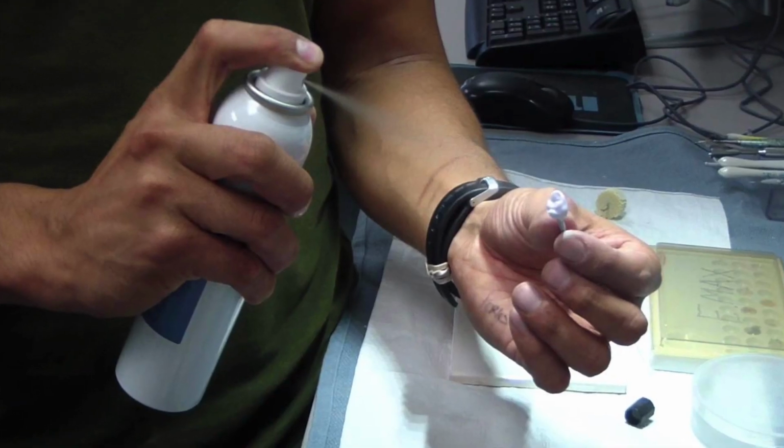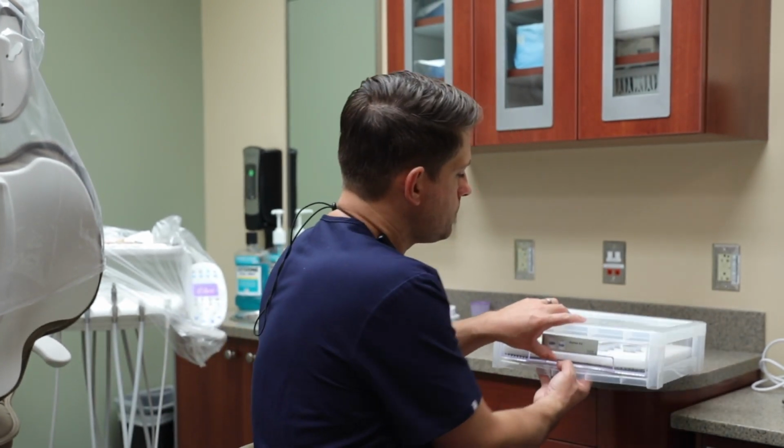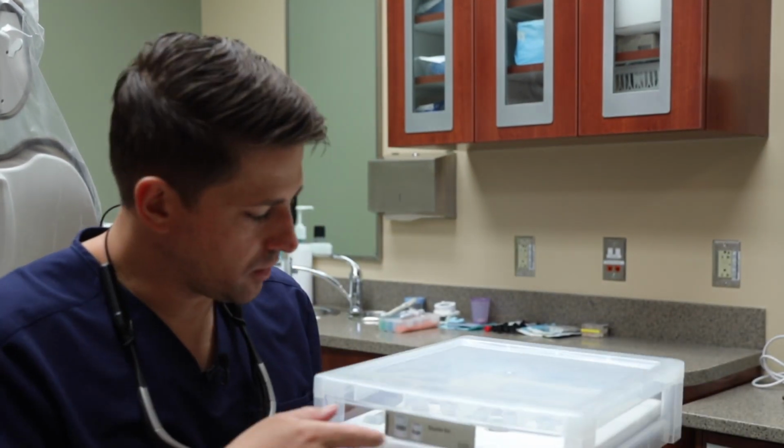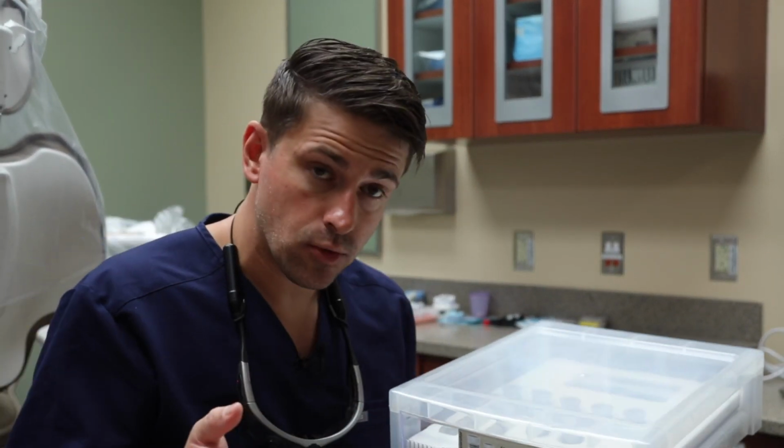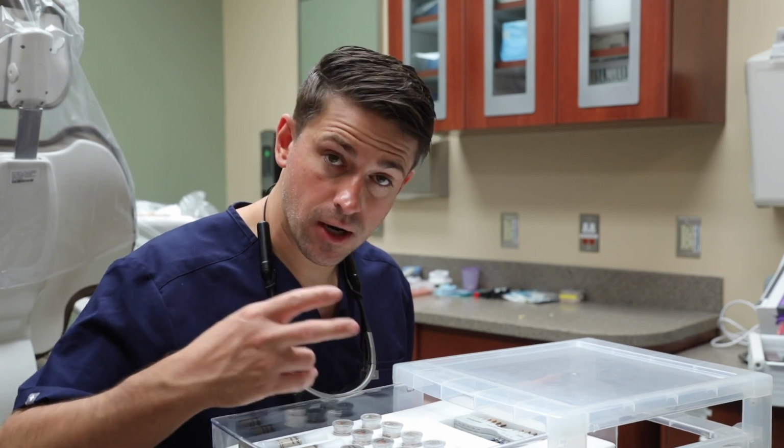So whatever you do in your clinical practice will kind of dictate how you make these custom shade guides. If you do spray glaze for everything, then I would spray glaze these crowns and call it a day. If you do 2 separate firings for your anterior crowns, like I'm doing for this, then you do it that way. So it's really up to you. The Ivocolor system, I actually got this not too long ago. It's a really cool system. It's got a lot of great things in here. Specifically for making these custom shade guides, this system here has 2 different options for glaze.